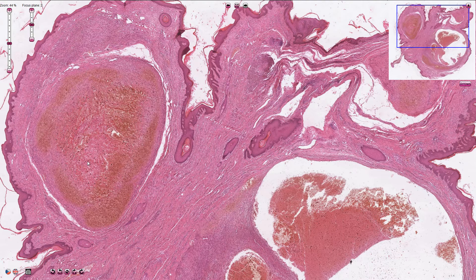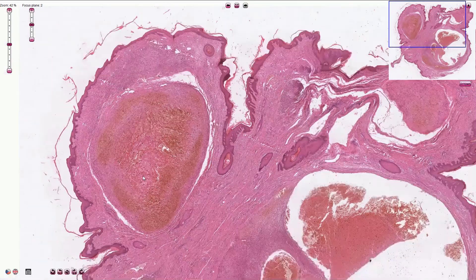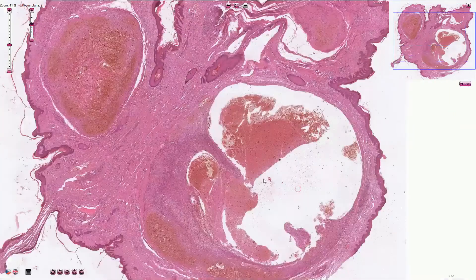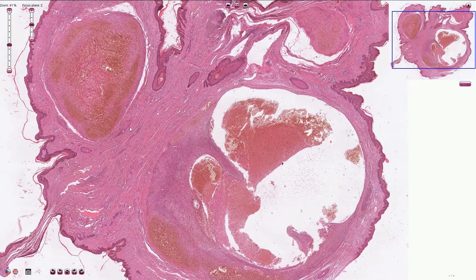We can call these external hemorrhoids. Internal hemorrhoids would be covered with columnar epithelium and the veins would be part of the superior hemorrhoidal plexus. External hemorrhoids are usually quite asymptomatic unless they are associated with thrombosis, as in this case — and then they are quite painful. So this is an external hemorrhoid with thrombosis.